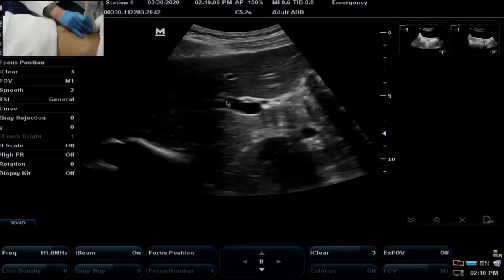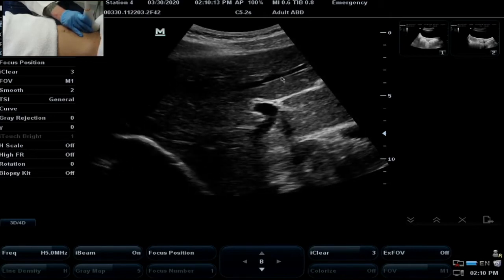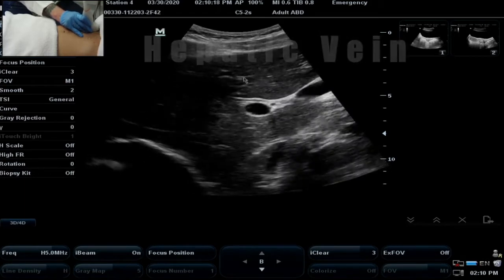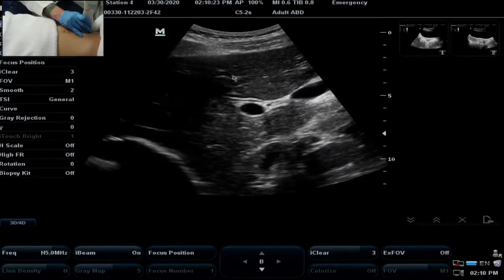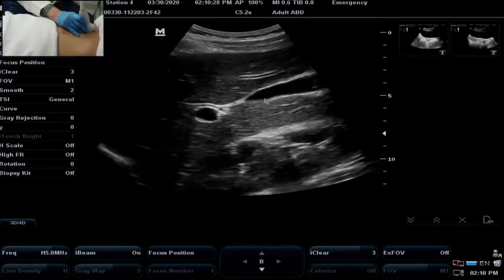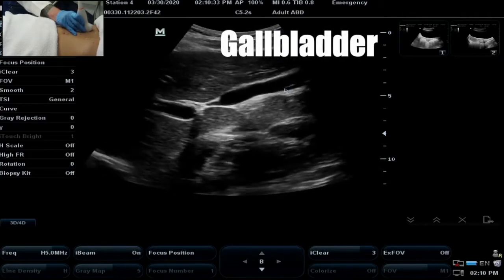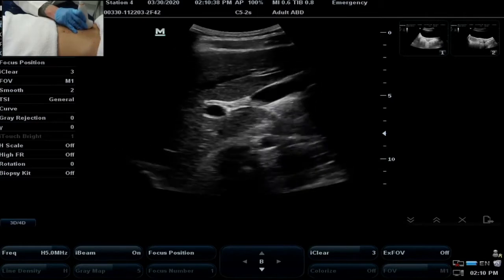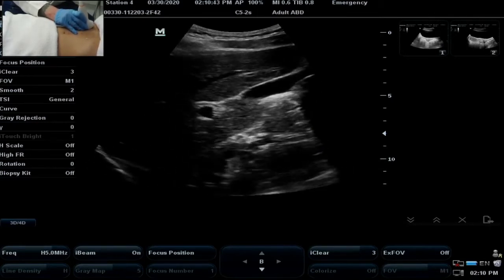And big breath in, please. And hepatic veins do not. So here's a hepatic vein with a hypoechoic walled vessel. And here are little pieces of portal vein throughout the image with bright walls. Here, as we move into the right lobe, also you'll see the gallbladder. So this hollow pouch filled with bile. And then also at about this level, breath in, please.